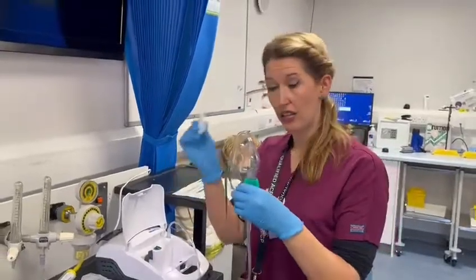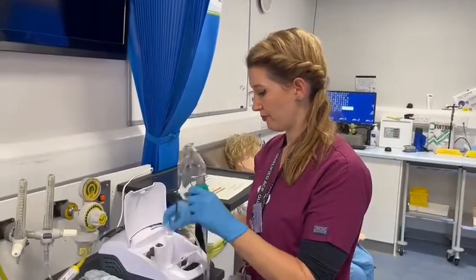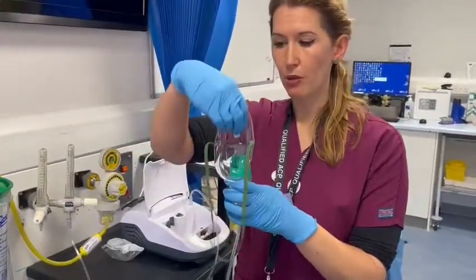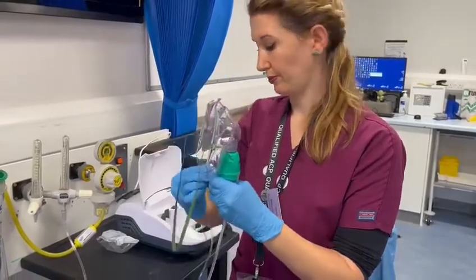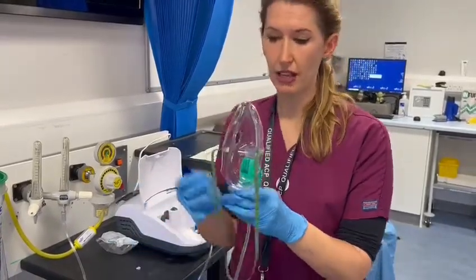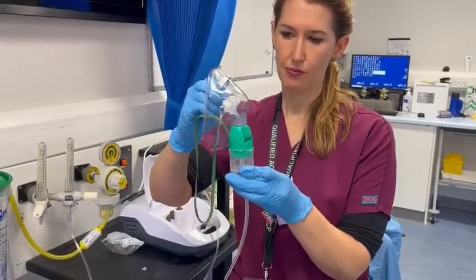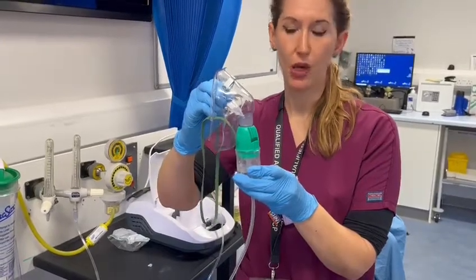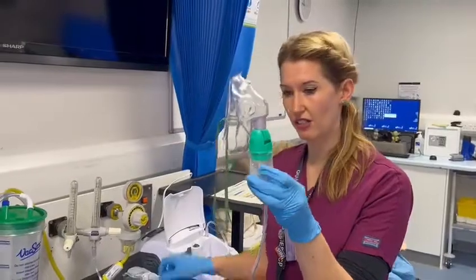I've then got my nebuliser solution, whatever that may be. What I'm going to do is open it and pour it down into the middle of the device. You can also put it in before you actually put on the top of the face mask, and you can see the solution is there in the chamber.